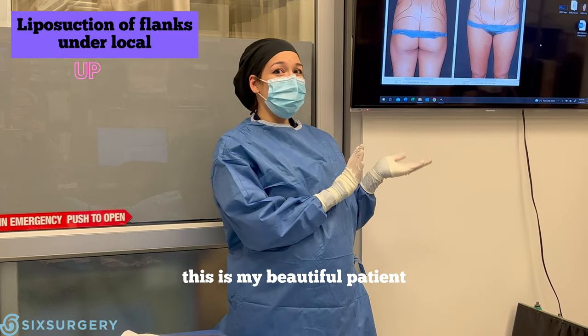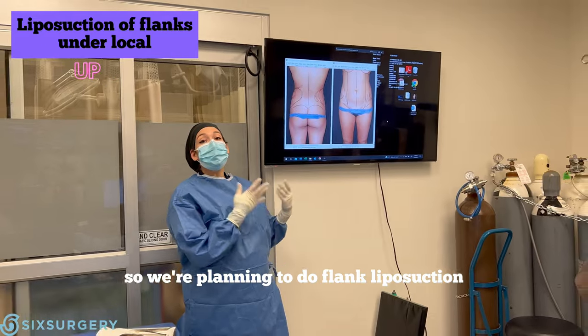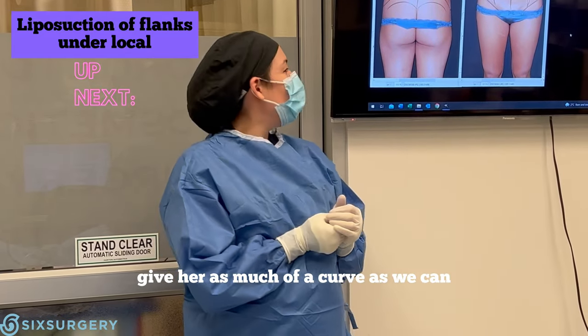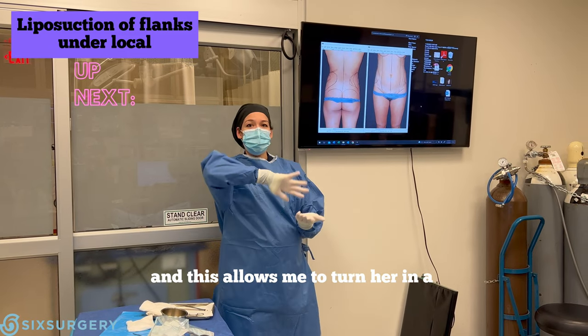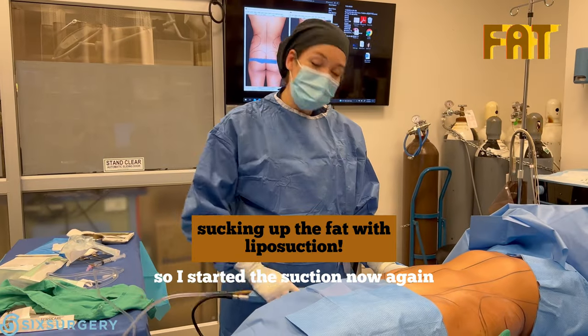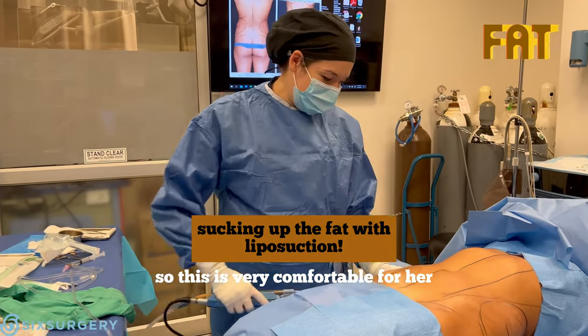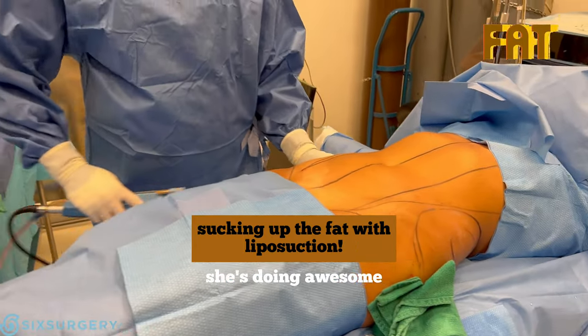Welcome to the OR. This is my patient — you can see she's very slim. We're planning to do flank liposuction to really narrow the waist and get as much of a curve as we can. We're doing local freezing, which allows me to turn her 360 degrees to get all the way around. I've started the procedure now, and our patient is totally awake, very comfortable. The freezing is in and she's doing awesome.